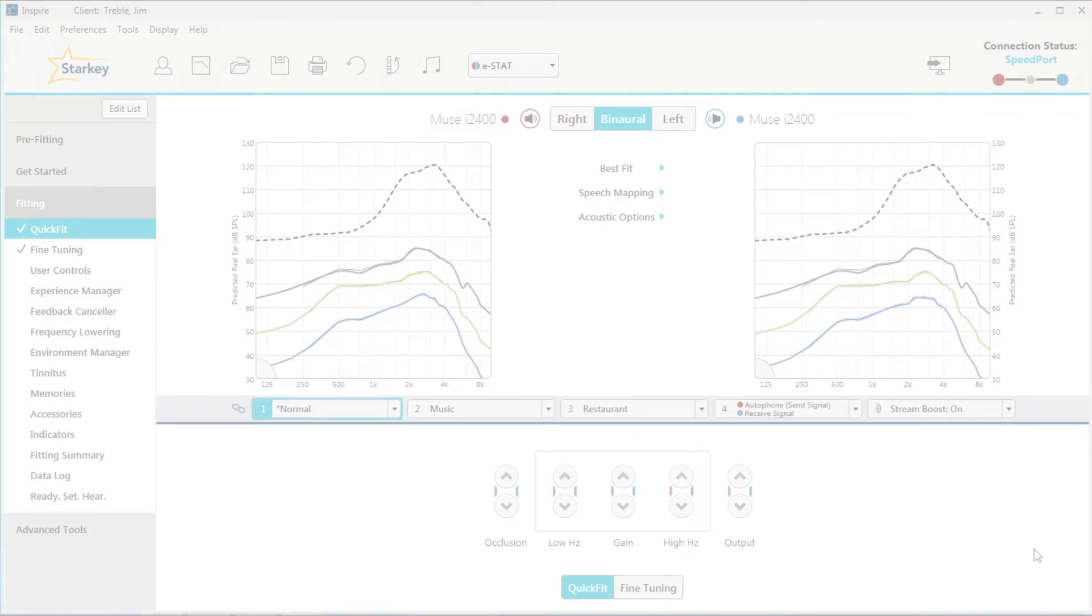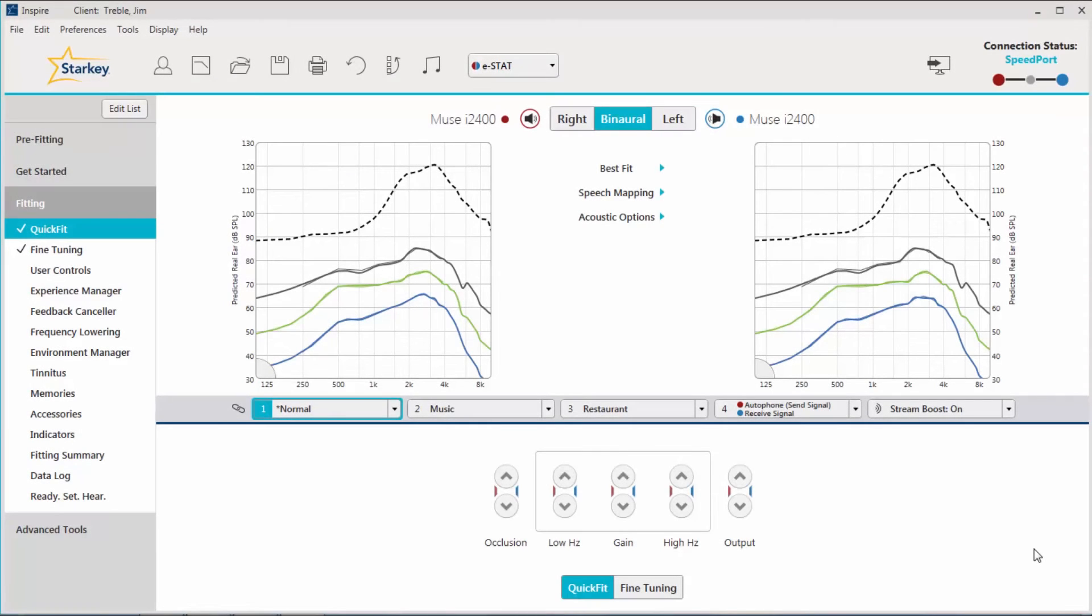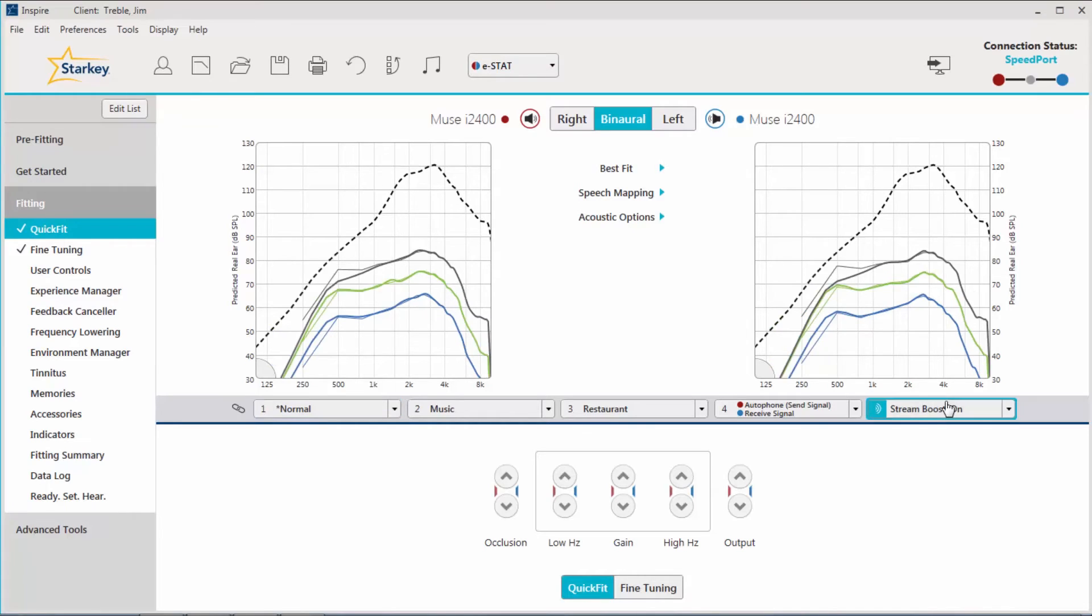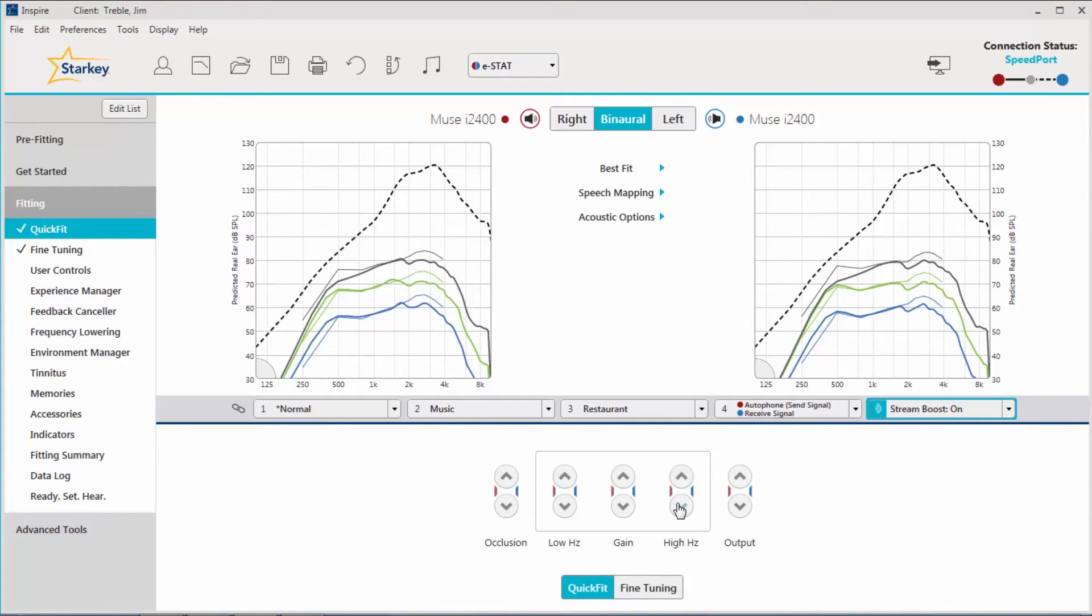If the patient reports the streamed signal to be a little harsh or tinny, a simple adjustment to the StreamBoost memory can be made. Within Inspire 10, select the StreamBoost memory and reduce the gain for high frequency sounds. If that doesn't solve the problem, try increasing the gain for low frequency sounds.